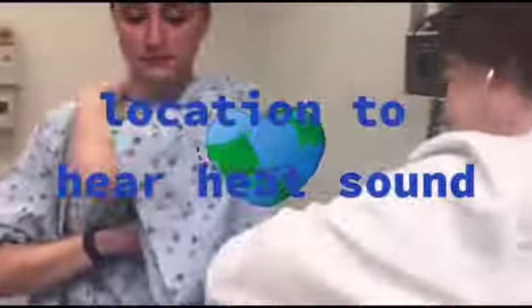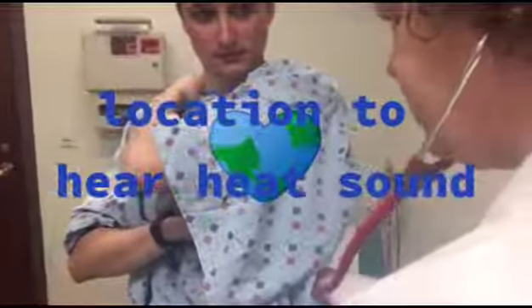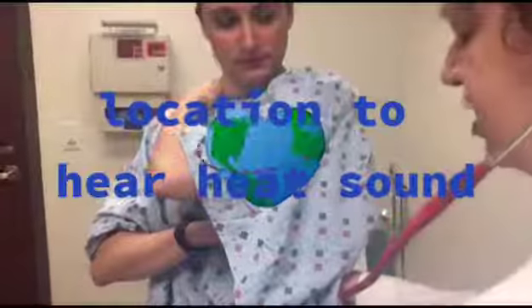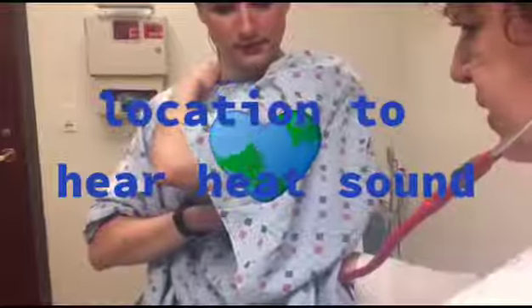Okay, now you can put this up. And for the 4th valve, I'm going to ask you to lift your left breast with your right hand. Okay. And I'm going to come in over this on the side of your gown, and I'm going to place the stethoscope in the mid-clavicular line, 5th intercostal space, or as close to the 5th intercostal space as I can get while preserving my patient's modesty. Okay, thank you very much.